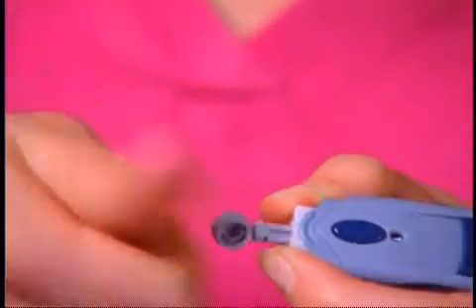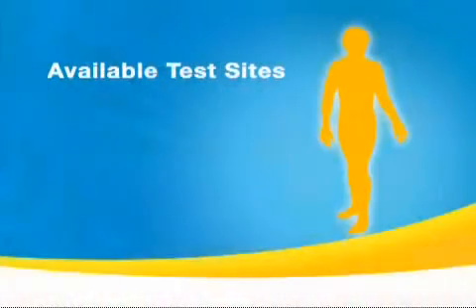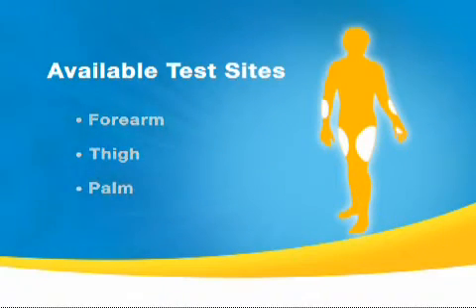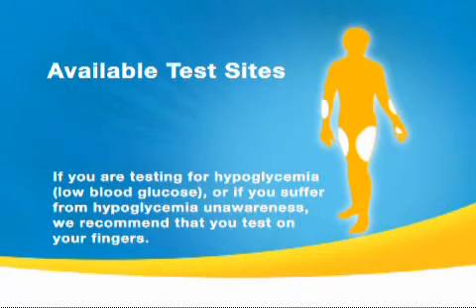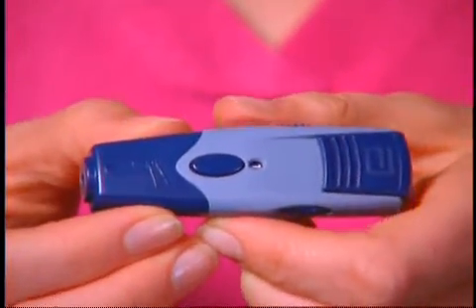Holding the lancet firmly in place with one hand, use your other hand to twist off the rounded top, exposing the needle. The FreeStyle Light System allows you to test on alternate parts of the body, such as the forearm, thigh, and palm. The flexibility of being able to choose different sites as you test throughout the day is a great benefit. Because we're going to start by taking a blood sample from the finger today, we need to select the dark cap and snap it back onto the device, being careful that it doesn't touch the exposed needle on the lancet.